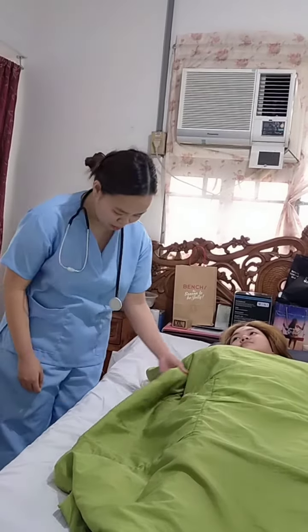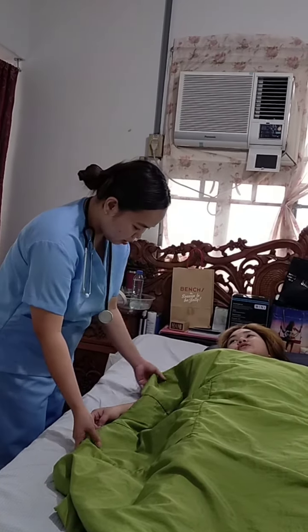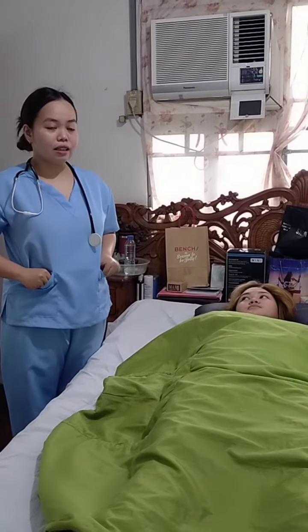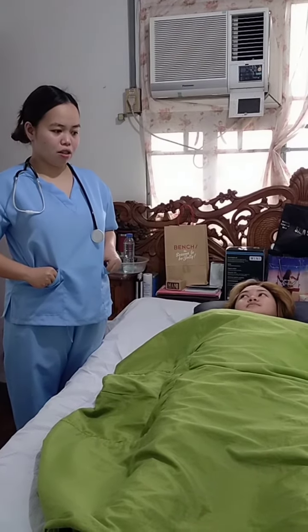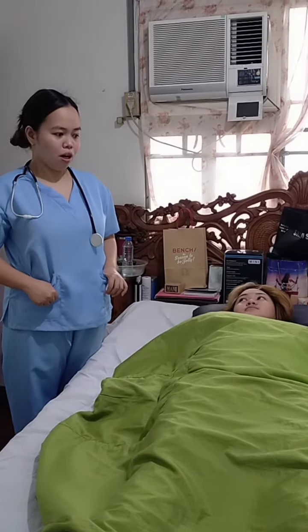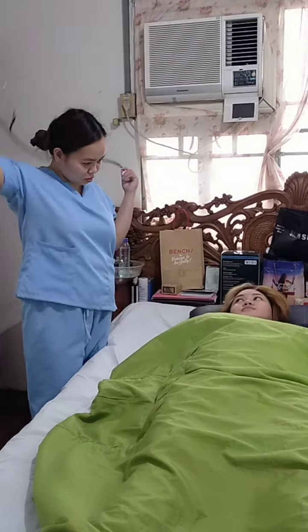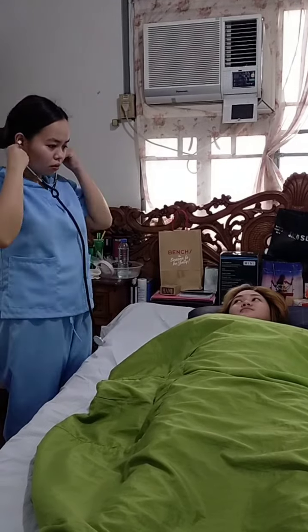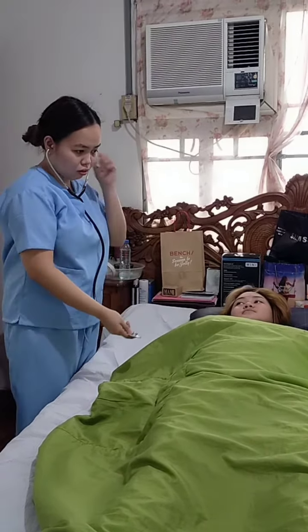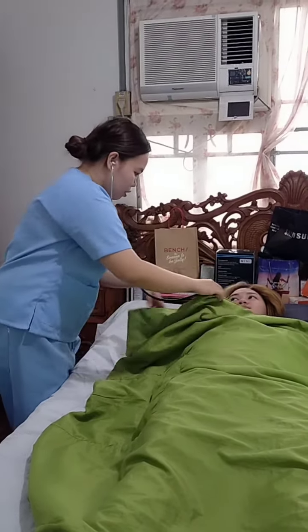May I know your name, ma'am? And your birthday? December 24. Okay, thank you. Assess the client's abdomen so you can determine the presence of bowel sounds and the amount of abdominal distention. So we'll be checking using the stethoscope. Ma'am, I will be checking you.